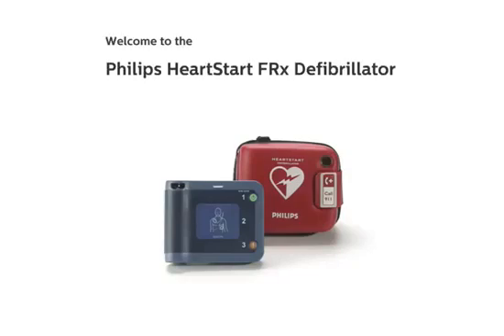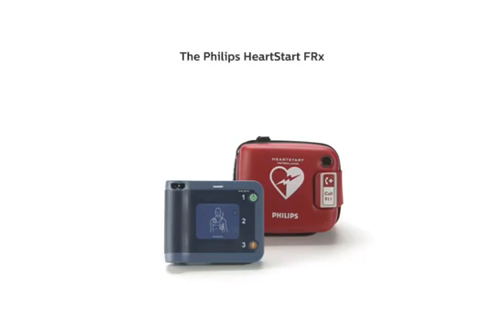Welcome to the Philips HeartStart FRX Defibrillator Demonstration. The Philips HeartStart FRX is designed to be an easy-to-use, rugged, and reliable automated external defibrillator, designed specifically for those who get there first. This demonstration illustrates the functionality of the HeartStart FRX, including easy-to-follow voice instructions and descriptive visual icons that take you through each step of the process.